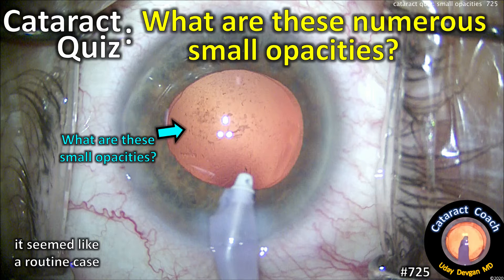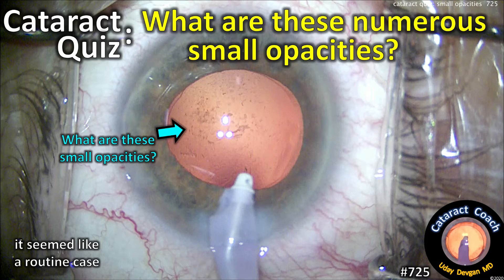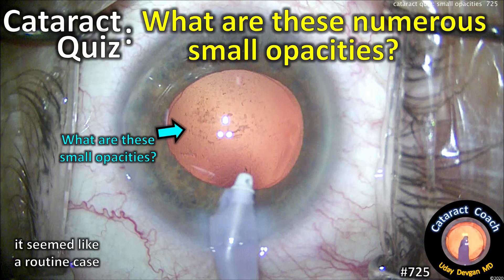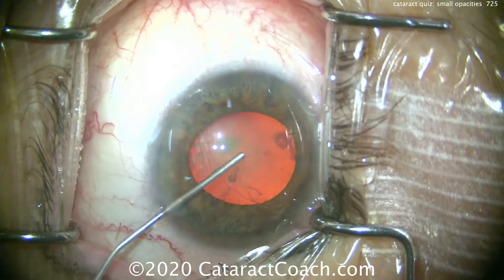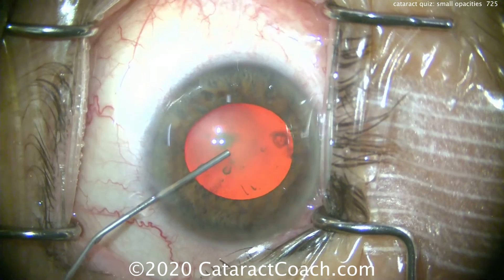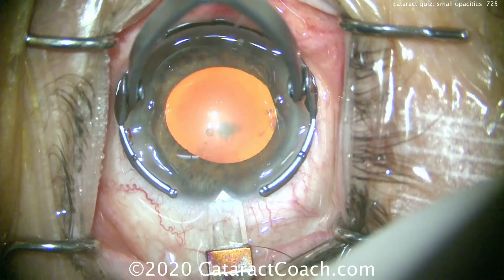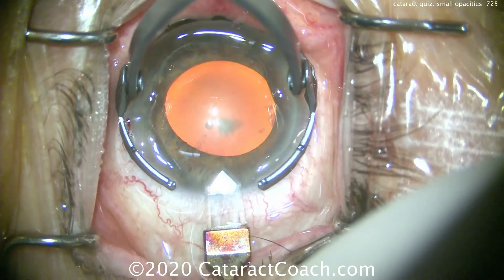CataractCoach.com cataract quiz: what are these small, numerous opacities in the center of the red reflex? This seems like a routine case, but this patient has pseudo-exfoliation. We can see that material on the anterior lens capsule and the modest dilation.